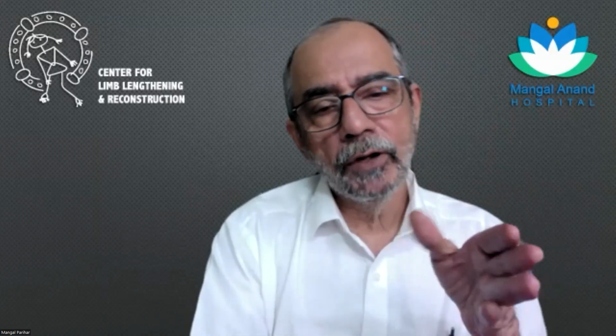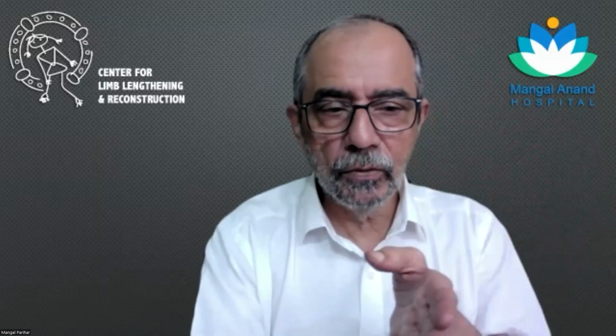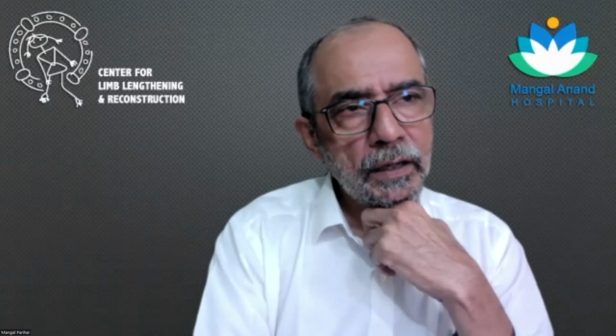So if I am in doubt, I will always prefer to go with a fixator, either a monolateral, or there are some of these patients who got really bad varus knees. There I will not hesitate to use an Elizarov. Ultimately, it's less trouble as far as I'm concerned.